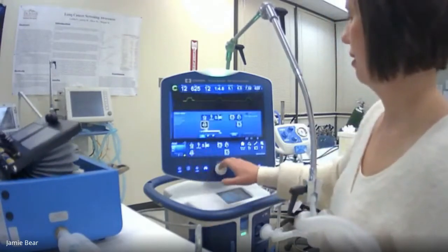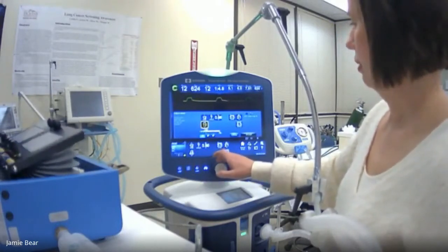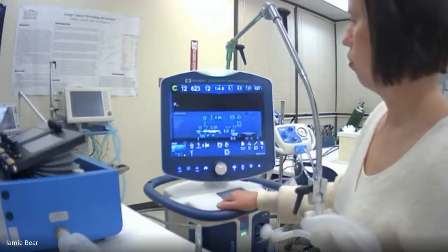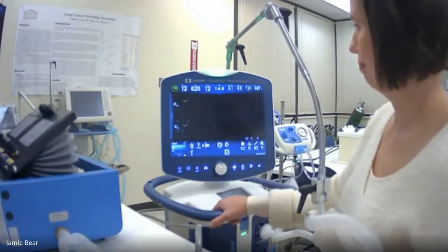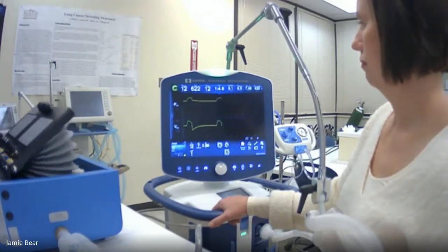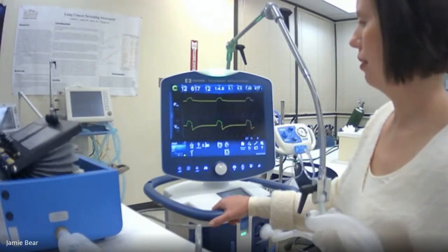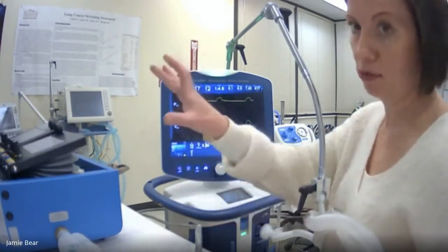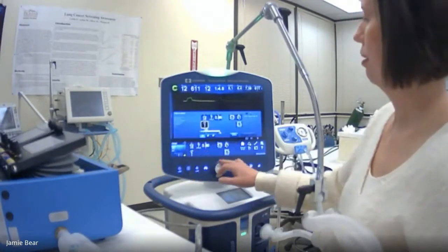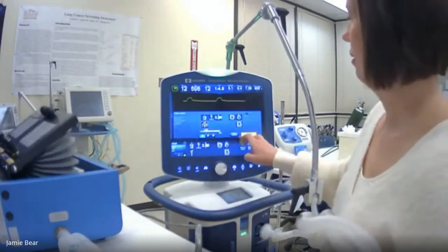Now this is really sensitive, as we can go all the way down to 0. Okay, so let's try that. Or we can go to 1. So we'll go to 1. Now watch our curves. Everything looked pretty good. Okay, we got that breath in, and everything looked pretty good, because once again we have these really compliant lungs. So this is the rise time of 1% versus, let's go all the way to the opposite end of 100%.